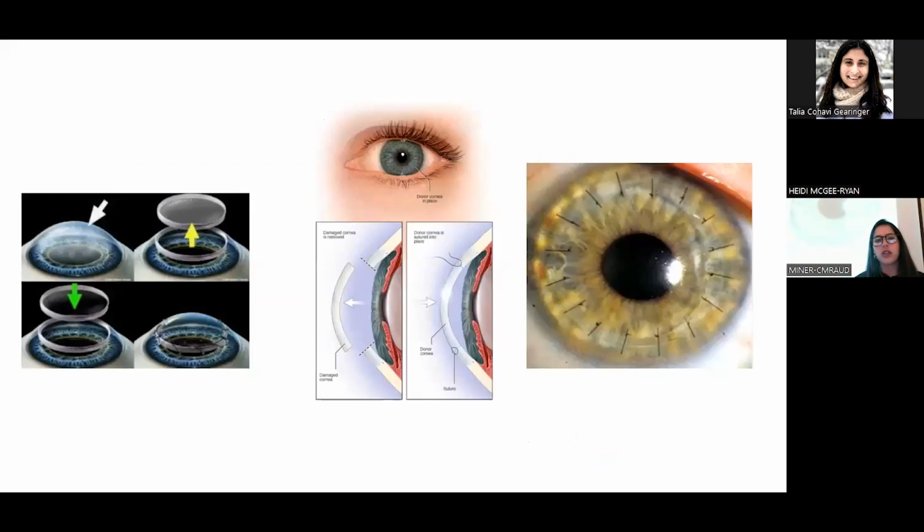So here is just an image of how it works. We can see here, for example, a patient's cornea. What we do is called a trephination. We cut to a specific size depending on the scar and the patient's cornea. We just cookie cut that cornea, then cookie cut the transplant cornea as well, and then we suture the cornea into the patient's eye.